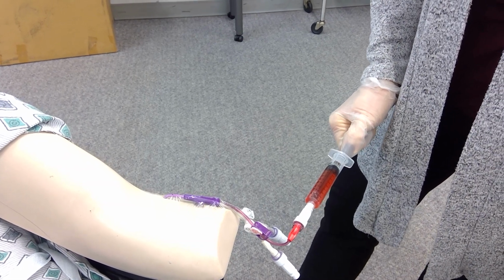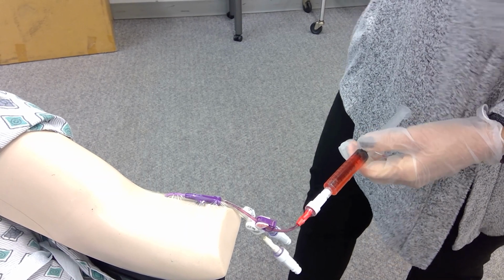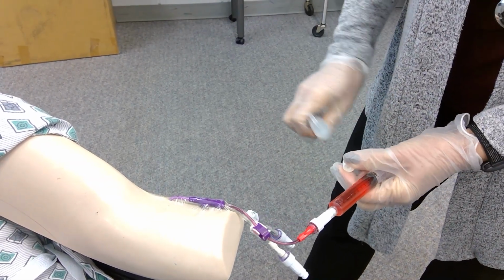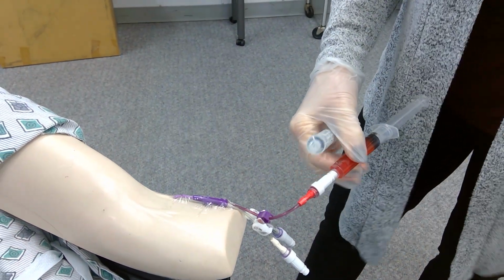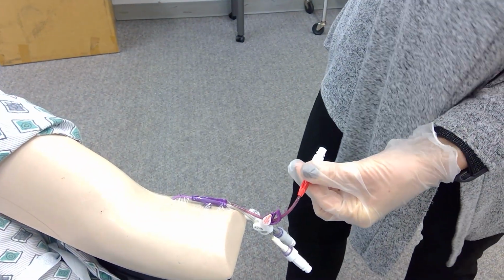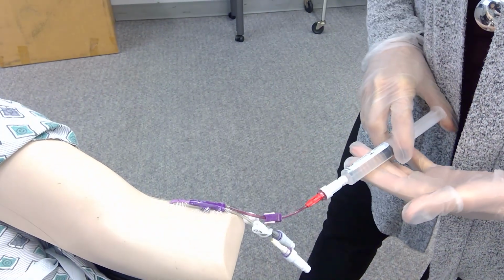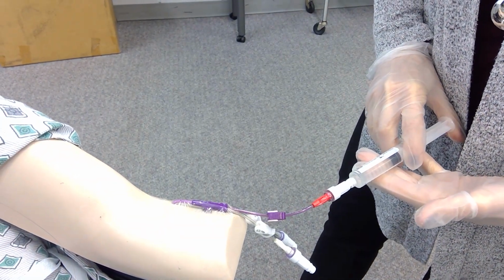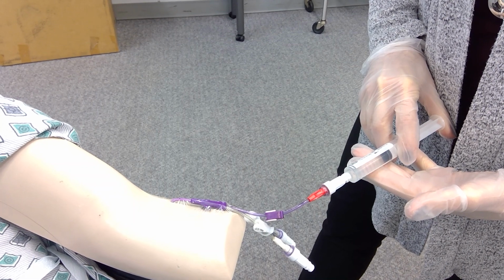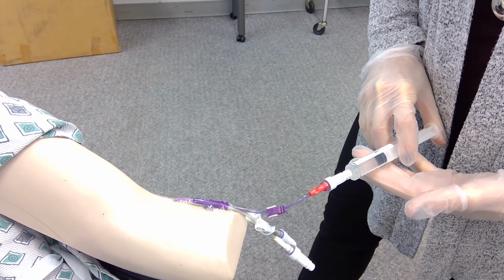I'm going to go ahead and pull back 10 mLs. Now that I've got my sample, I'm going to flush my line. And I'm just going to flush slow and steady, flushing the whole 10 mLs.